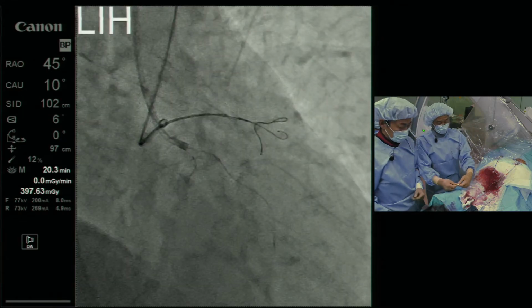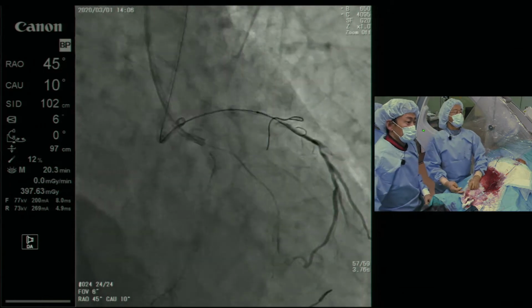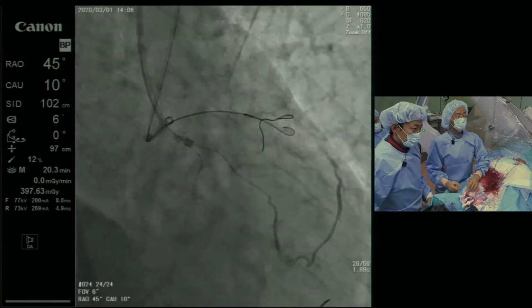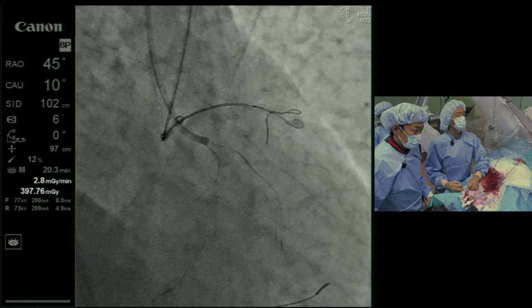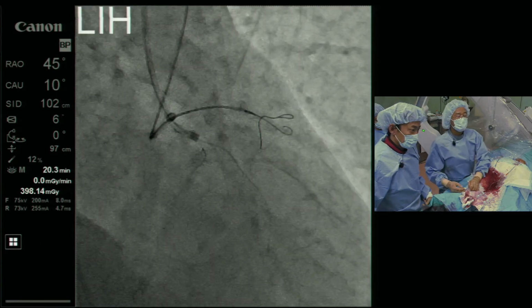Okay, let me see the last shot again. So this part is very clear. Even the most experienced persons in the world still will give an adequate trial for the antegrade. Even though this retrograde appears to be sizable, and I think for those who are in the business of doing retrograde, it's probably not one of the difficult ones, so it should rather walk in or float in through this.